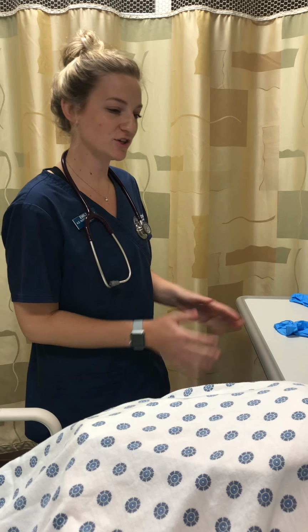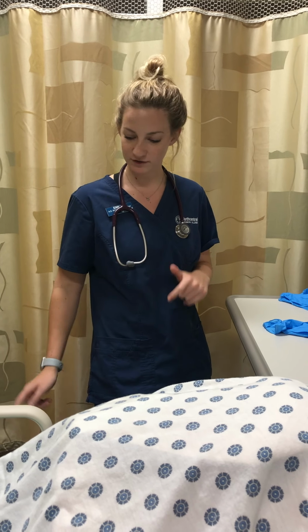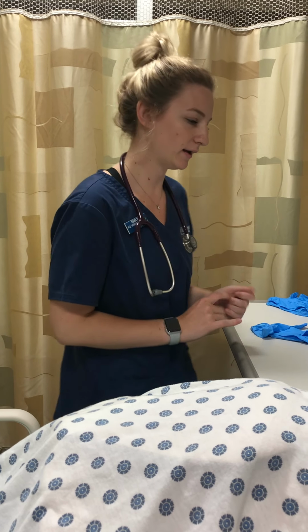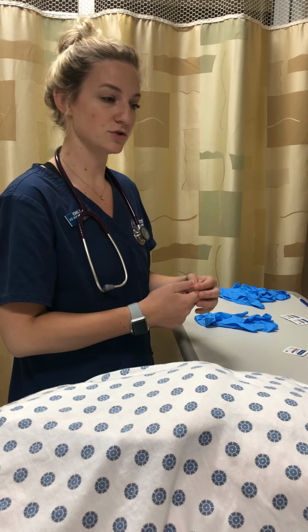Okay, I just started my shift, so I'm going to go ahead and assess this patient. I did a little research before, and it looks like they have a chest tube, so we're just going to go ahead and enter the room. I'm going to knock. I'm going to wash my hands right away. I'm going to introduce myself.